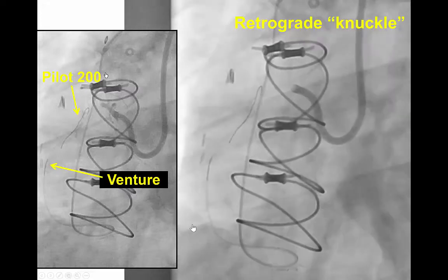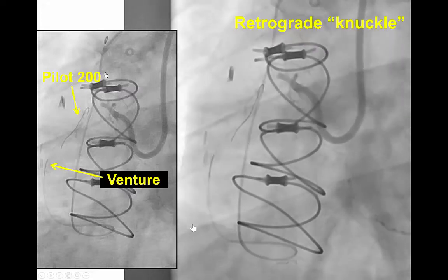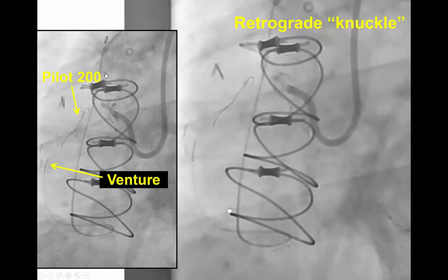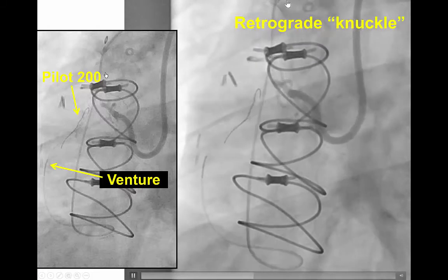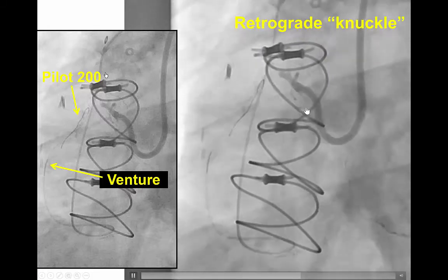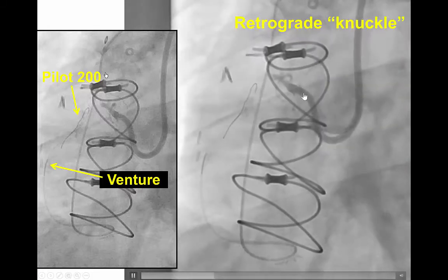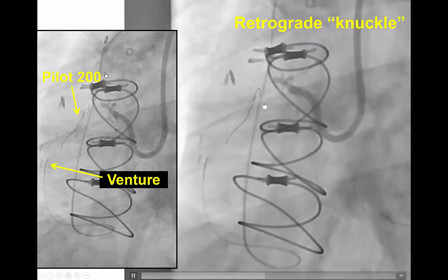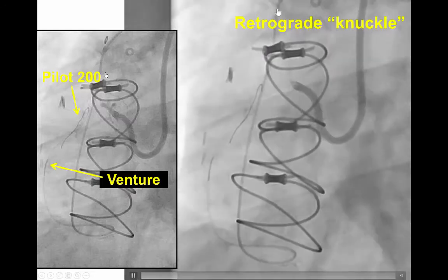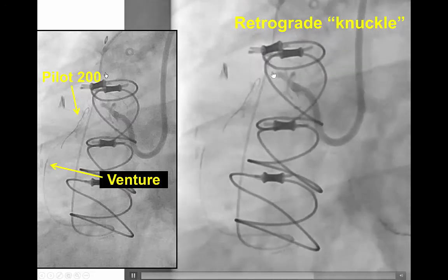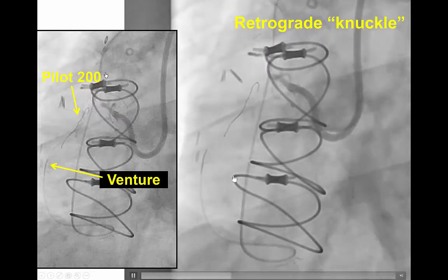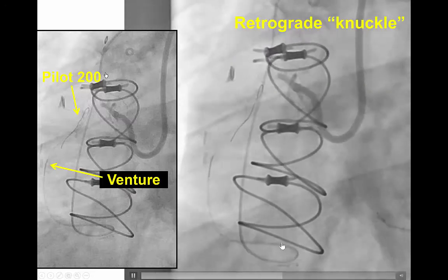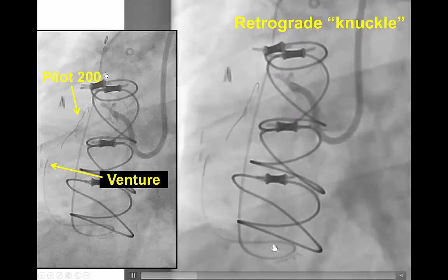We proceeded with dual access. The vein graft was engaged with a multi-purpose 8 French guide, the right coronary with an 8 French AL1 guide catheter, and then we were able to easily advance a guide wire down the vein graft into the posterior descending artery.